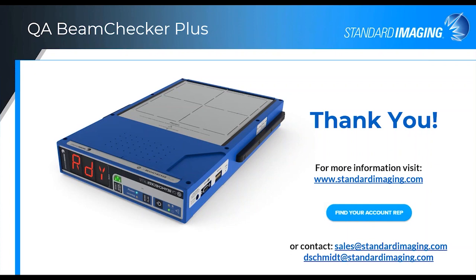Let's see, I do have one more here. Spacing between the detectors, they are on a 15 centimeter, well, 7.5. So from the center to the outside, 7.5 centimeters, center to this side, 7.5, center to the top and to the bottom. So center to center from outside to outside, axial or longitudinal would be 15 centimeters, so that is fully encompassed by a 20 by 20 field.